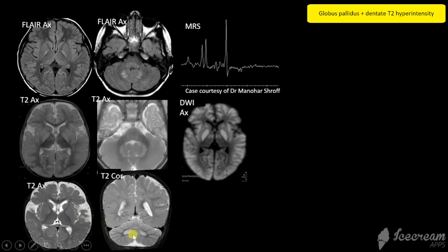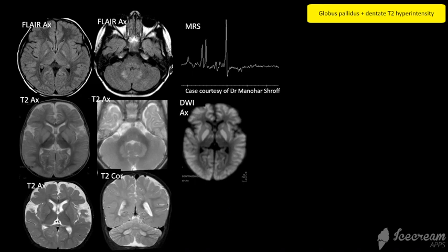The third case has very striking abnormality in the dentate nuclei with mild signal change in the globus pallidus, and this child responded clinically and radiologically to vigabatrin, which is very characteristic of SSADH deficiency.